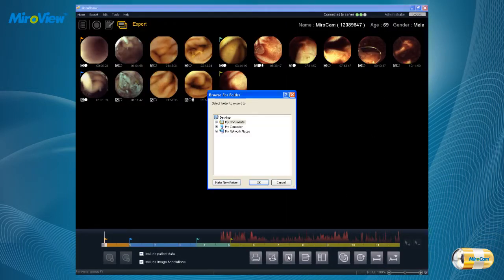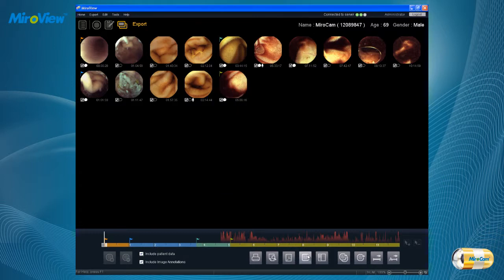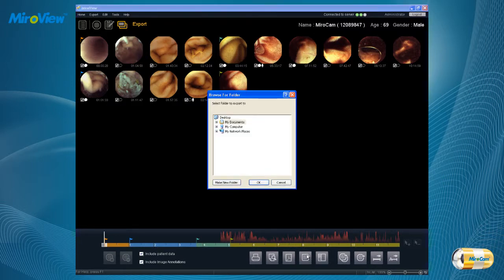Click on the Save as PDF icon to save the report as a PDF file. The user can print out the report and/or save the report to a PDF file. Click on the Export Review icon to export review data only, without the video. Review data is MiroView's own video format, which contains captured images and comments by the user.